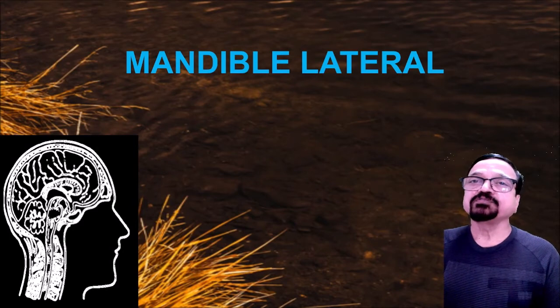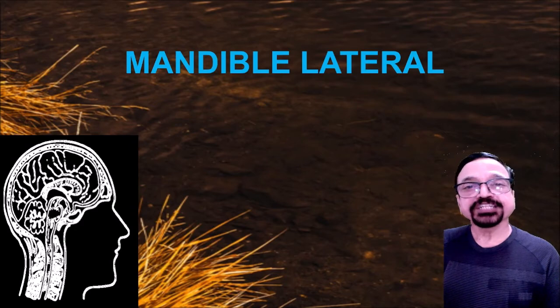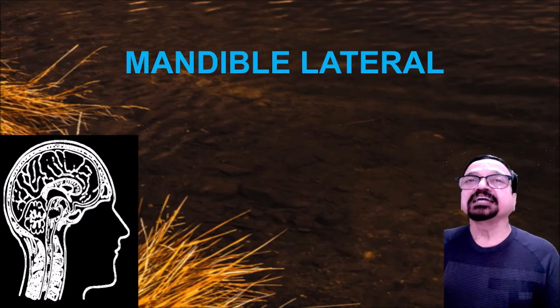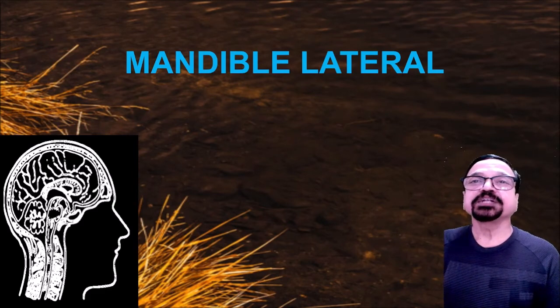Mandible is a part of skull. It has the TM joint, but its projections are totally different from those of the skull. It has its own specialized views, and the views are separate because the mandible has multiple turnings and varying thickness of bone, as well as a joint, the TM joint, which is totally different from other joints, with a movement like anterior sliding. Therefore, radiography of the mandible by itself is a real challenge for radiographers.